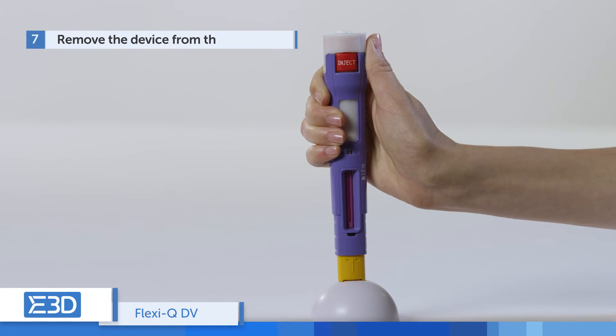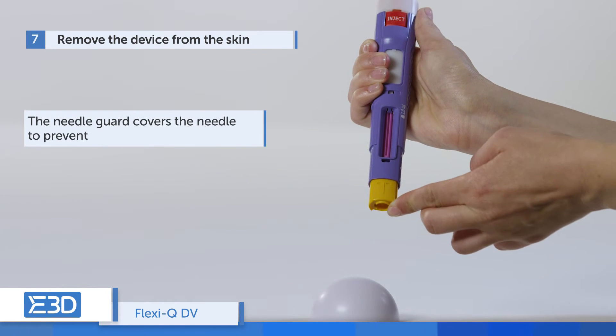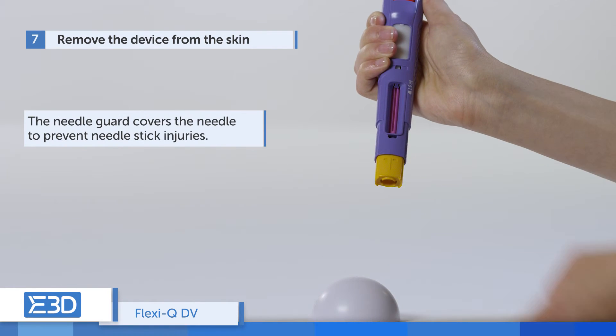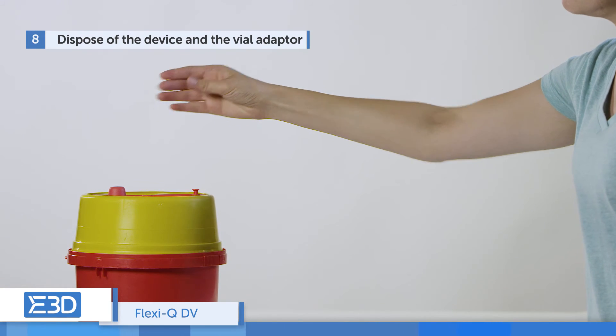Remove the device from the skin. The needle guard moves forward and covers the needle to prevent needle stick injuries. Dispose of the device and vial adapter in a sharps container.